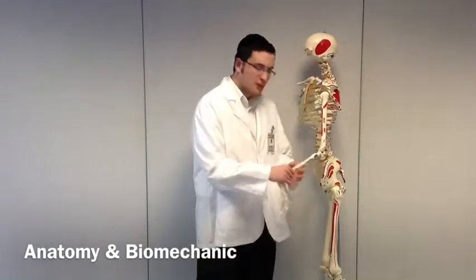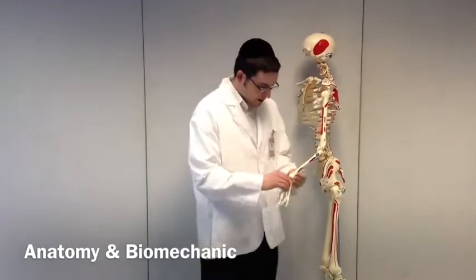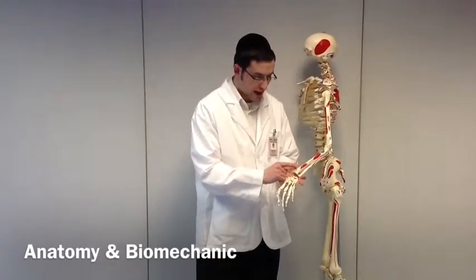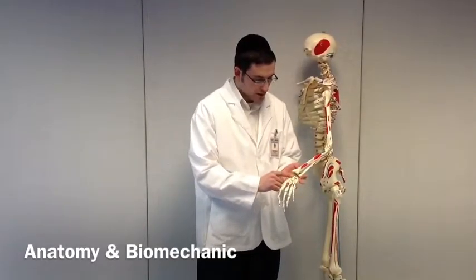Welcome. Today we'll be talking about ulnar deviation and how to measure it through goniometry. First I'll be speaking about the anatomy. We're going to be talking about the radiocarpal joint in terms of ulnar deviation, where we have the radius, the scaphoid, the lunate, and the triquetrum.